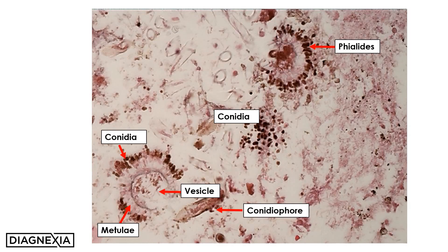Also noted are remnants of conidiophores. These are the heads of a conidiophore that have been decapitated and are somewhat degenerate. But one can identify conidia peripherally, underlying metulae, as well as phylides which give rise to the conidia. A central space is noted and this corresponds to the vesicle. When intact, this represents the conidiophore.